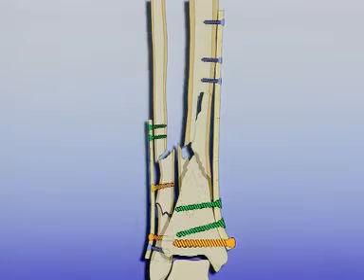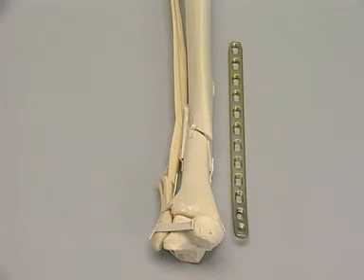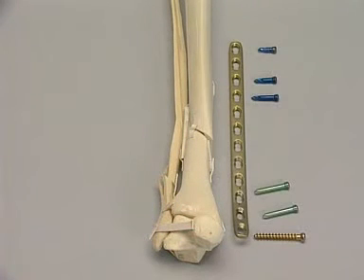Drawing in and fixation of the broken-off segment with a cortex screw is optional if the segment is still seriously dislocated. Some surgeons would fix the fibula first to give alignment and length, which makes percutaneous stabilization of the tibia much easier. These implants are available for use on the model.